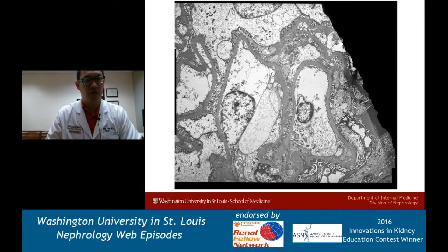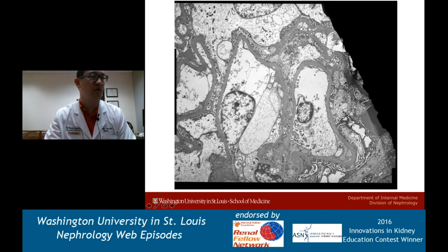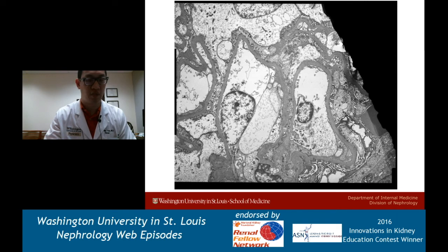Here's an electron microscopy low-power image of a capillary loop. In this glomerulus, it looks pretty healthy. Let's orient ourselves: here we have a mesangial space, the capillary loop and basement membrane, the subendothelial area, and the subepithelial area - blood space versus urine space. There are no electron-dense deposits visible. There might be some areas of foot process effacement, but no electron-dense deposits, again indicating that this is a pauci-immune process.